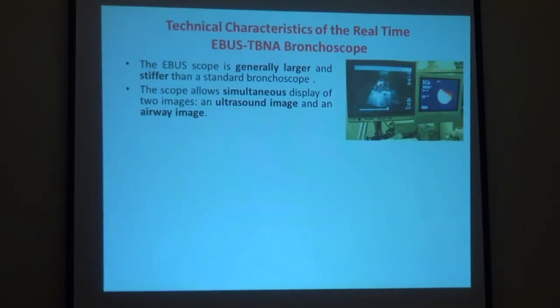فدي نقطة مهمة. تاني حاجة إنك لازم يبقى عندك سيمالتينيوس فيو، تشوف الاثنين مع بعض. هو المفروض بيديك سايد شاشة في الأجهزة، زي صورة صغيرة في الكورنر، لكن الأفضل إنك تحط صورتين جنب بعض عشان تقدر تشوف. لو بتعمل مانيبيوليشن مش تفضل تغير من الصورة الصغيرة وتكبرها، فأفضل لو عندك الصورتين مع بعض. خصوصا بتوع بنتكس عندهم الجهازين لازم يبقوا الاثنين جنب بعض، عكس أولمبس فيه سب سكرين صغيرة، زي ما الدكتور حسن وريكم.